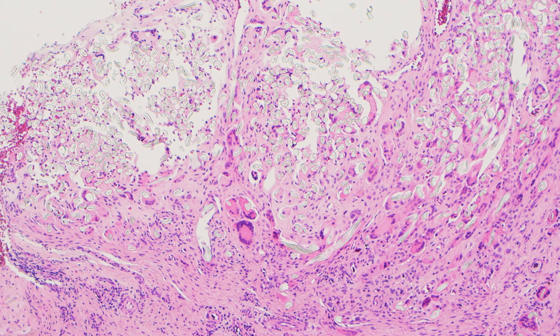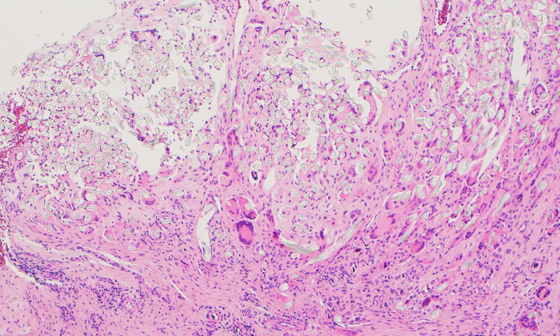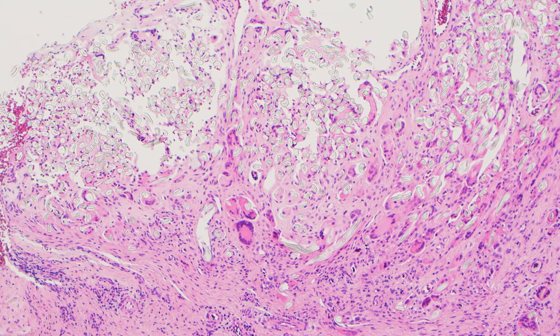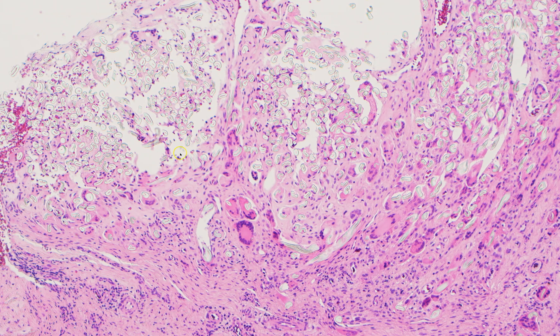Cotton fibers are used in gauze, bandage material, and all sorts of other stuff. I suspect this patient, because they had had surgery and a variety of open wounds over quite a long time, at some point gauze or bandage material was pushed down into one of the wounds or draining sinuses from their osteomyelitis and gangrene. A bit of that got stuck in the tissue, embedded, scarred around it, and then the giant cell reaction formed around it as well.